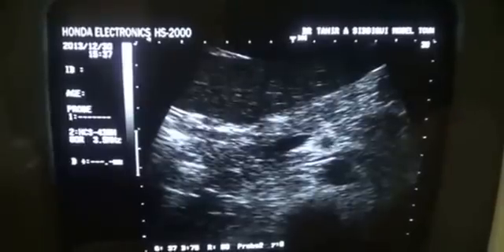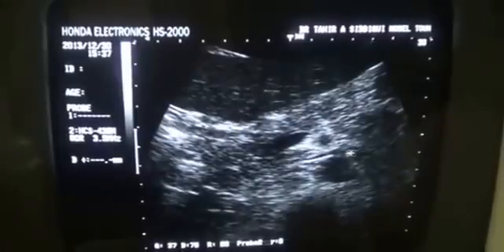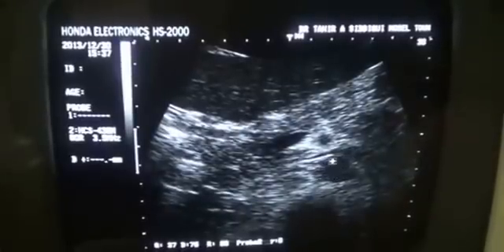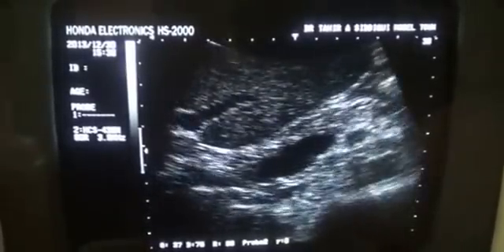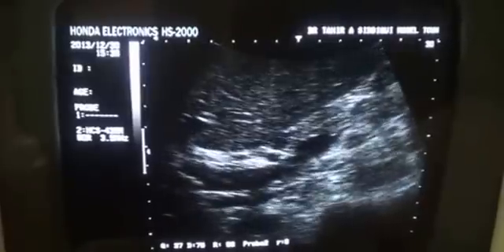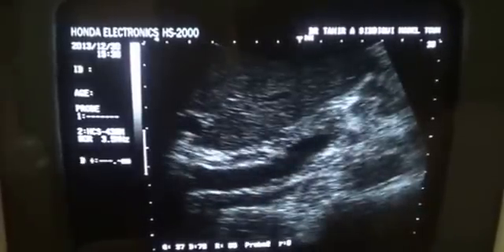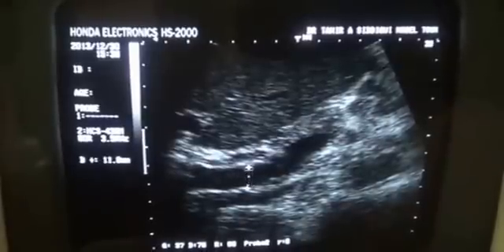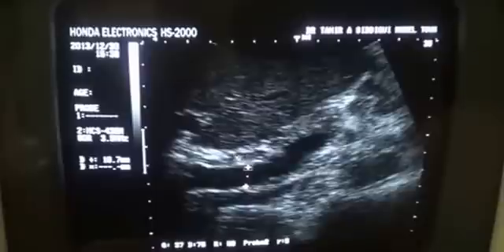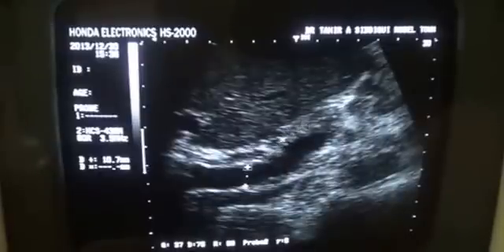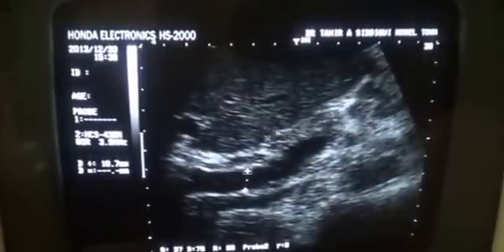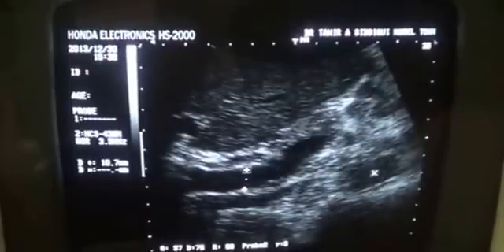In this position, when I give a little pressure to the probe, this is the superior mesenteric artery with the echogenic border. This is the left renal vein crossing anterior to the aorta. This is the porto-splenic confluence. This is the pancreas. Now, keeping the probe here, I am going to give a 60-degree sweep. You can see we can clearly see the portal vein and measure it from inner to inner border. We can see the whole length of the common bile duct as it traverses the posterior inferior surface of the pancreas. This is the head of the pancreas in longitudinal section. This is the aorta.